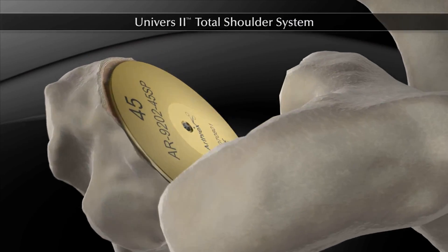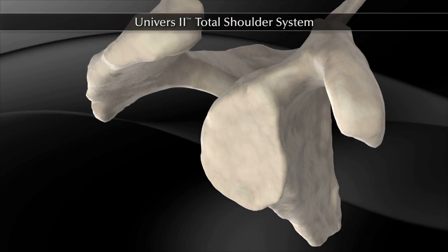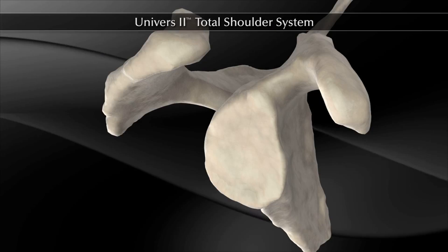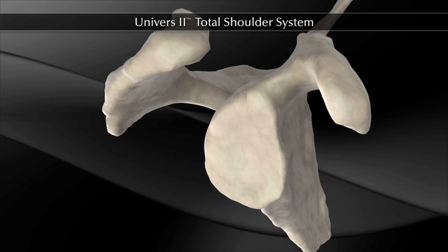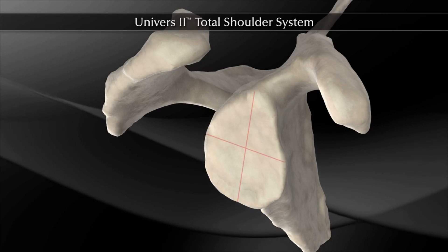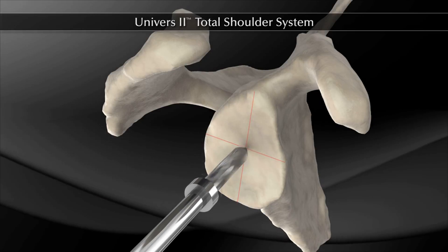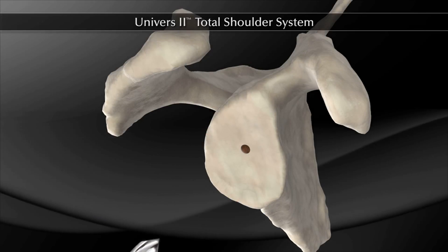Attention is then directed to glenoid preparation. The glenoid is prepared by removing cartilage and any additional soft tissue that may interfere with placement of the glenoid implant. Next, the center of the glenoid is identified and marked, and a small pilot hole is created at this center point.